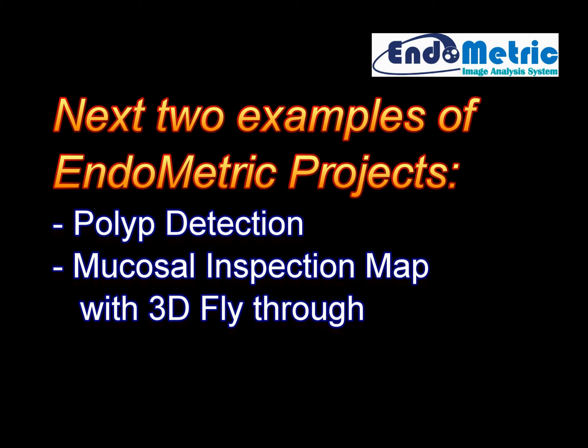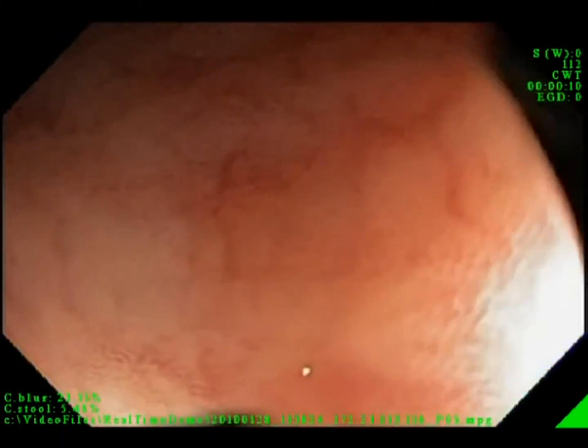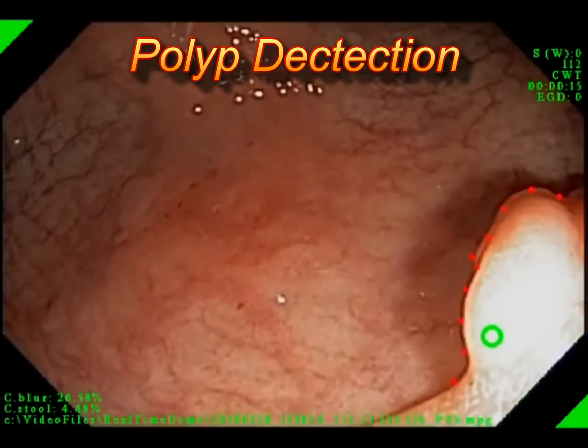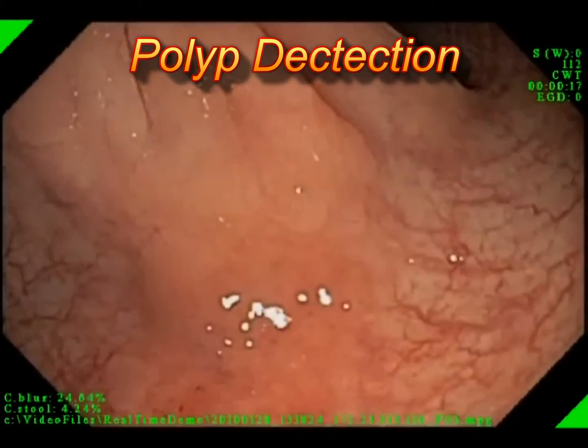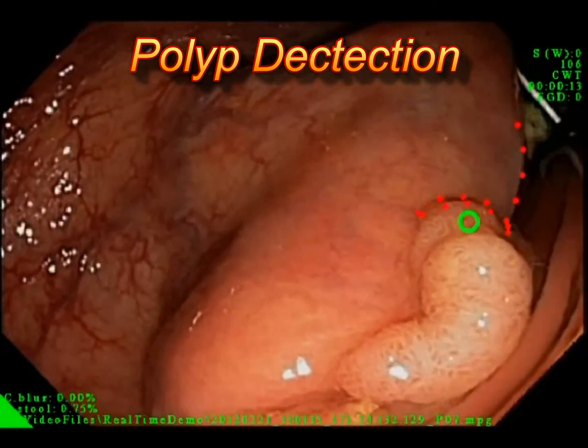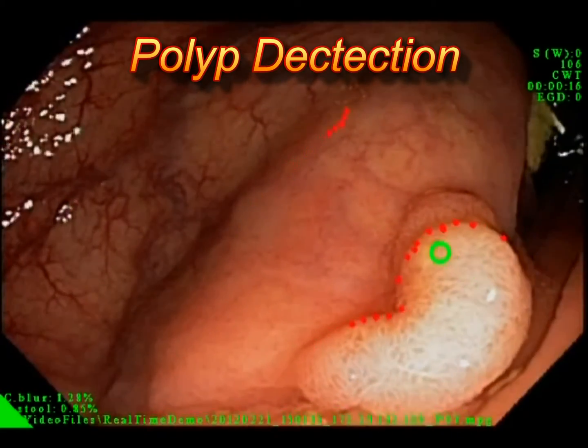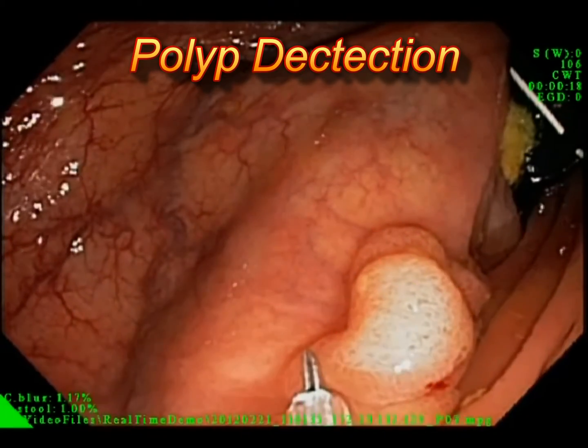Next, two examples of EndoMetric projects: polyp detection and mucosal inspection map with 3D fly-through. First, polyp detection. Here, EMIS is scanning the image in real time for polyps. Once a polyp is found, EMIS marks the outline of the polyp with red dots and places a green circle near the polyp to facilitate recognition.